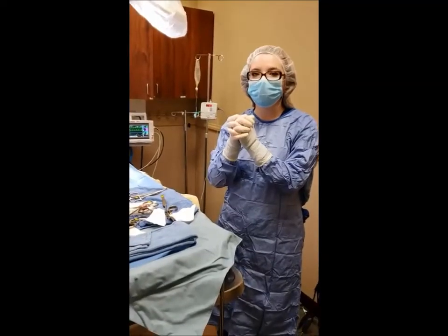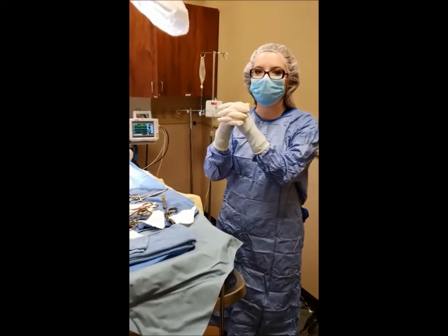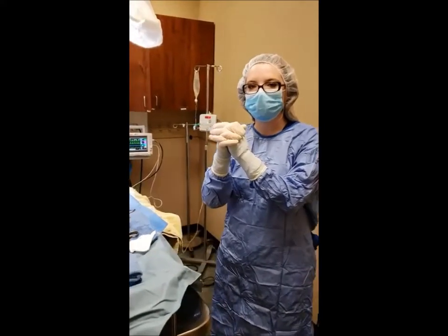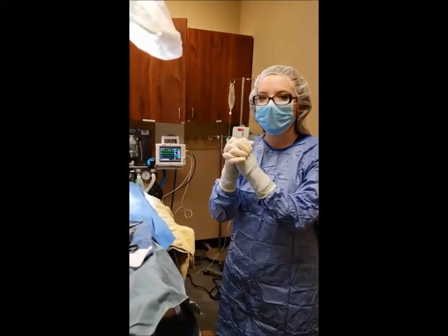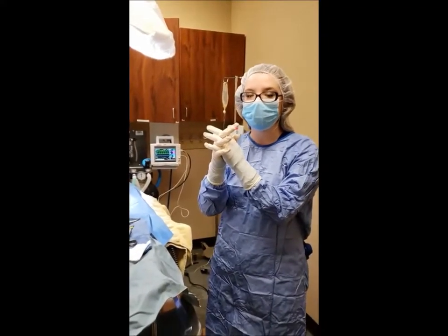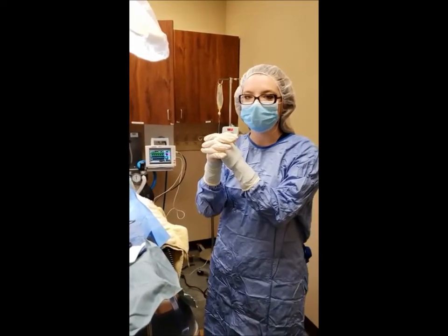Okay, in order to keep my sterile technique, I will keep my elbows and hands above my waist and keep my hands crossed when I'm not assisting the surgeon. In the event that I broke my sterile technique, such as dropping an instrument, I could ask someone to bring us another instrument. If I tore my glove, I would just go and scrub in again and re-gown and glove.